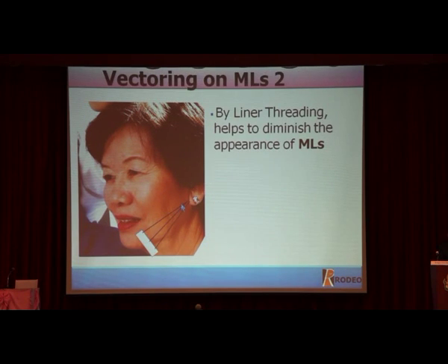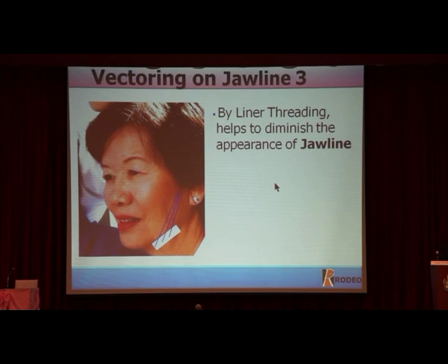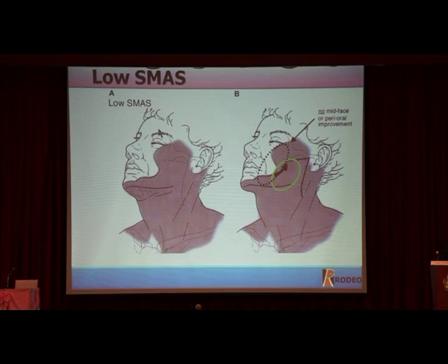Mid-face insertion is a mid-face, lower-face treatment. The thread is a vertical vector. First is the vertical vector, and second is lower-face lifting. Lower-face lifting targets the marionette point and the jawline. In many patients, the jawline effect comes from the vertical vector. The vertical vector is the jawline treatment.